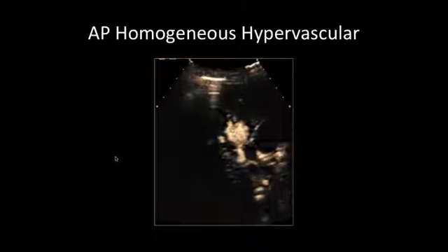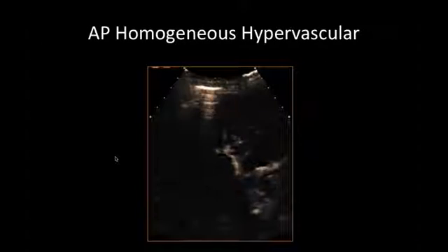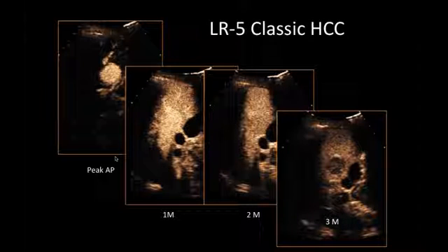When we look at this later, we can see our peak arterial image. At 1 minute, we can see that the lesion is still enhanced greater than the liver. At 2 minutes, it's isovascular to the liver. And at 3 minutes, it shows a washout pattern that is classic for HCC in that it is weak. There are still bubbles left within the washout region, and it is late, at greater than 1 minute. So this and many other examples I could have shown you are all exactly the same because they all have all three characteristics: size greater than 1 centimeter, arterial phase hyperenhancement, and late weak washout.